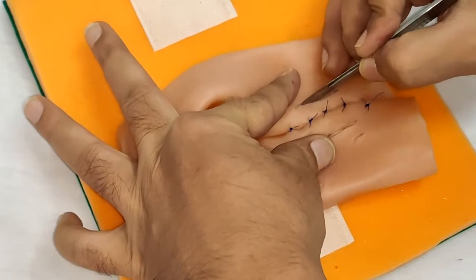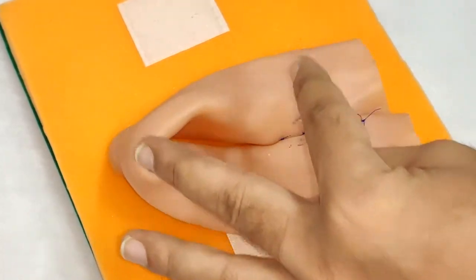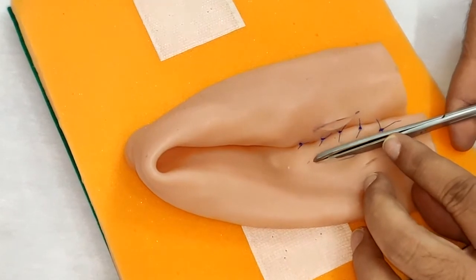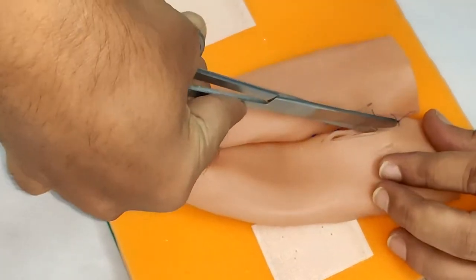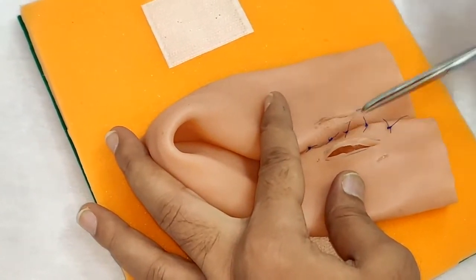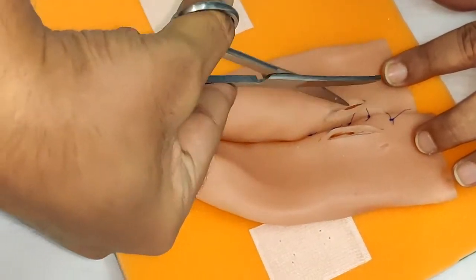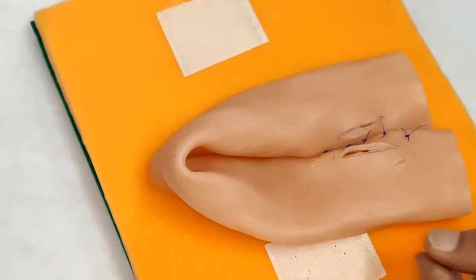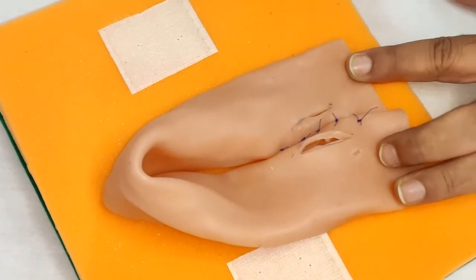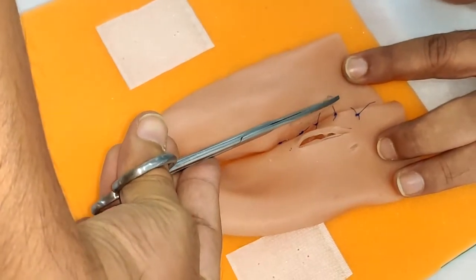We will make a small cut on the other loop as well. This will open up the bowel on both sides. With the help of scissors, we can open up the desired length, but we need to make sure that they are equidistant. These are your two lumens and now we will start suturing the two bowel loops.